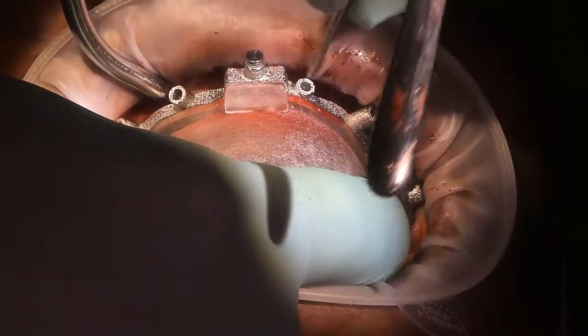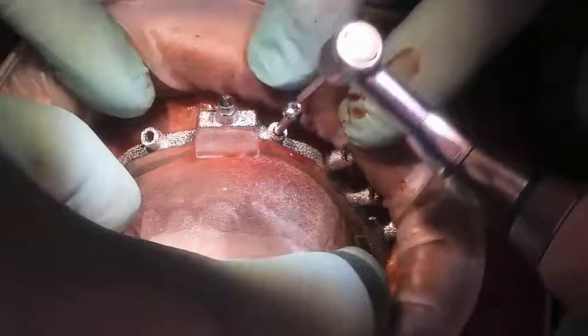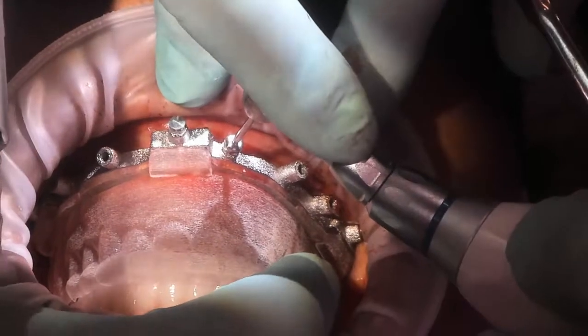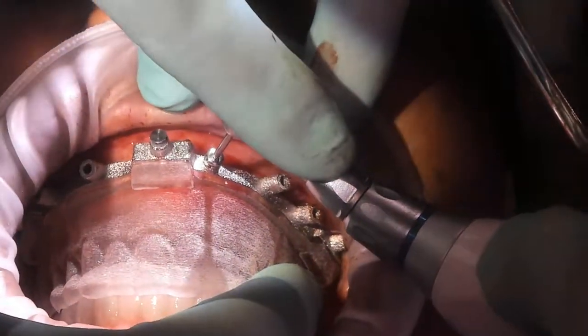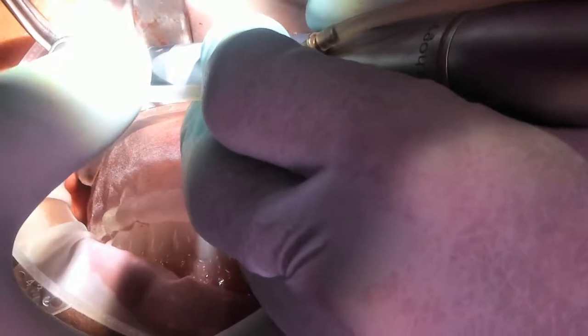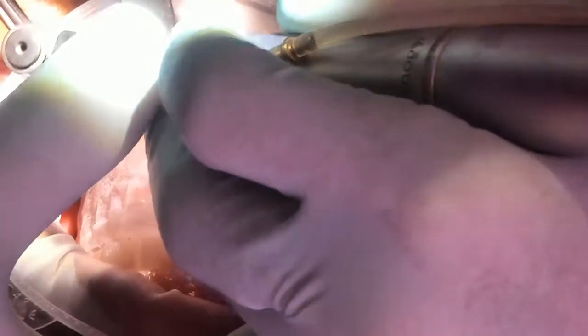Either option is acceptable. So again, just to reiterate, you can either place the pin guide, or in this case pin guides initially, and drill all of your sites, or you can lay the flap and allow the pin guide to rest just on the tissue on the ridge and the palate and the maxilla, and then drill the sites after the flap is laid. Either way is acceptable.